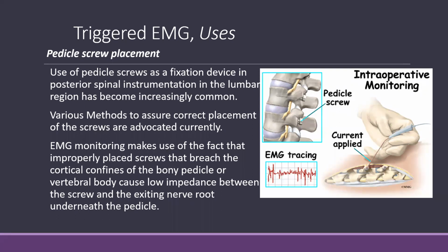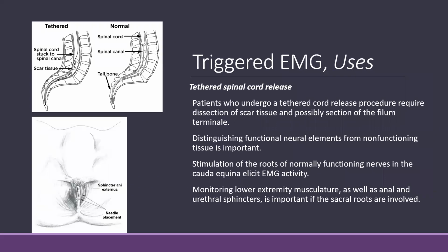Other methods that can be used besides just stimulating the screws after they're placed include navigation that uses CT imaging and registered instruments using technology pretty similar to motion capture. And of course, the tried and true method of fluoroscopy guided screw placement.